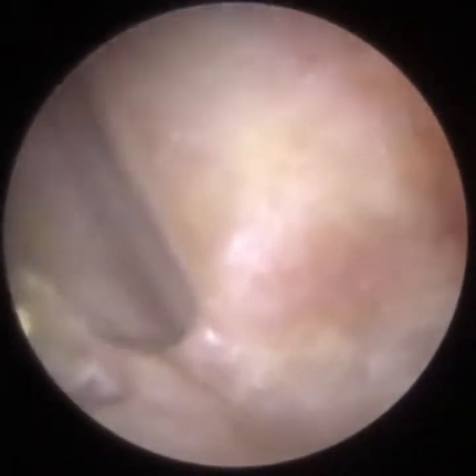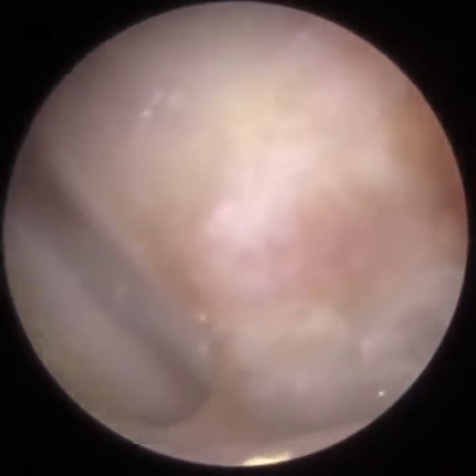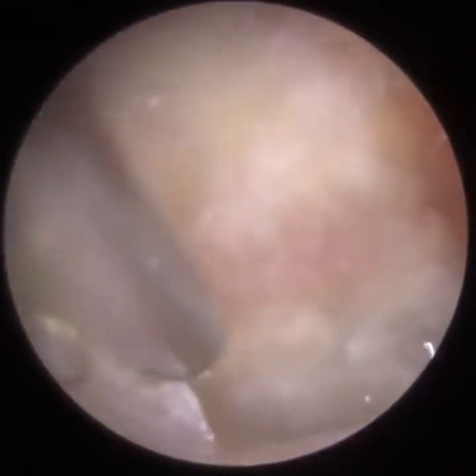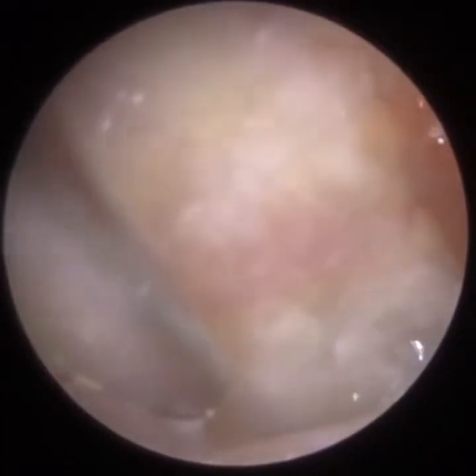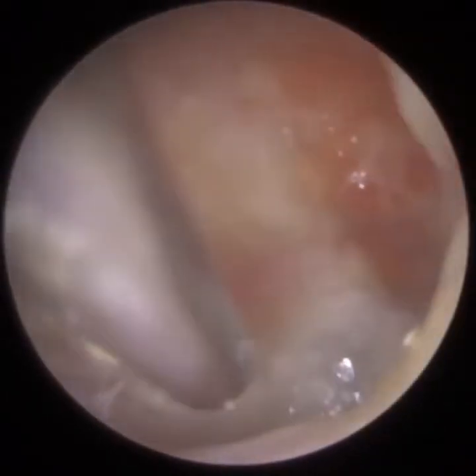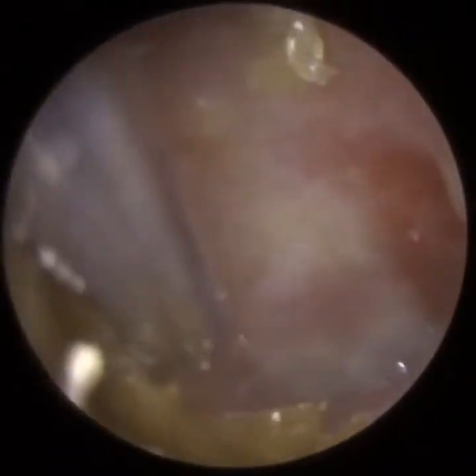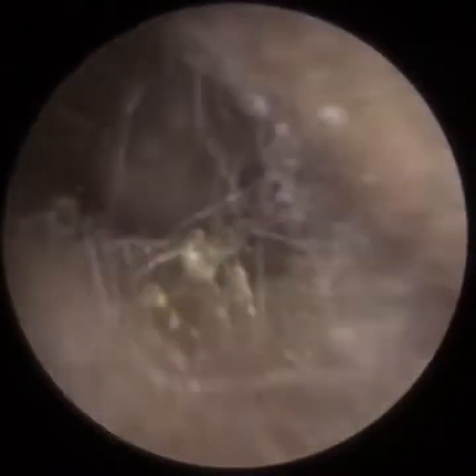Because the patient has a narrow ear canal, it can sometimes be difficult to manoeuvre the suction probe because there's limited space once we're in the ear. The patient has also got a very prominent inferior recess. Most people's ear canals incline upwards around 30 degrees, so there's an upward slope, and then about 0.5 centimetre away from the eardrum, the ear canal narrows and protrudes back out again.